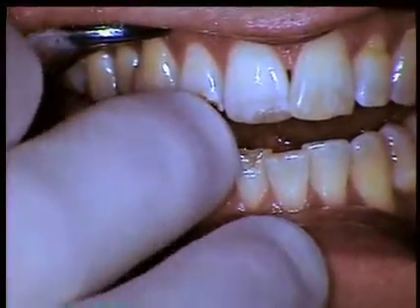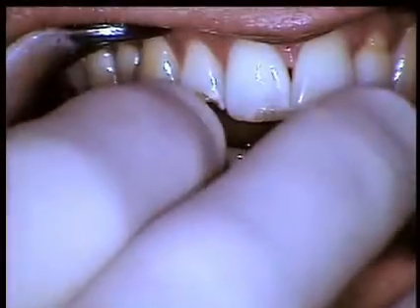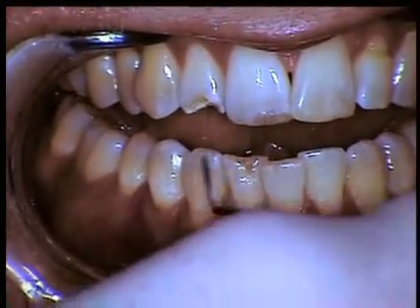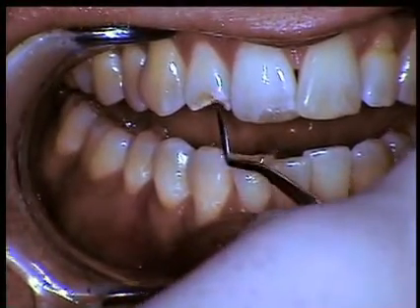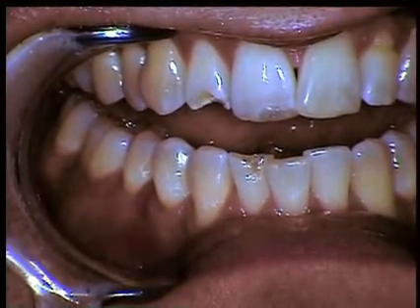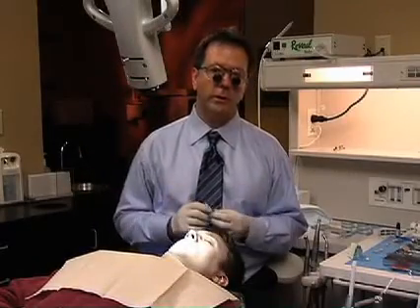One option is to freehand this — literally standing over the patient and sculpting. In a case this small, you could probably get away with it, especially for number eight. However, for number seven, because there is a lot of decay and we don't yet know how extensive it will be, I prefer to have a matrix. There are several ways to approach these anterior restorations depending on how much tooth structure you're replacing.